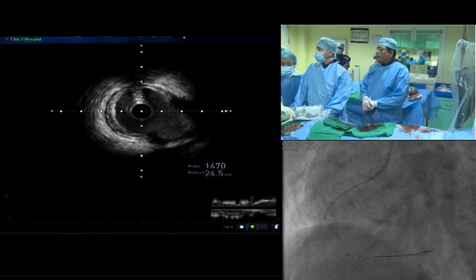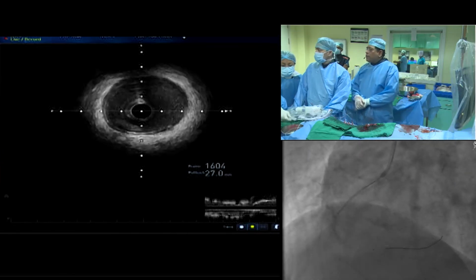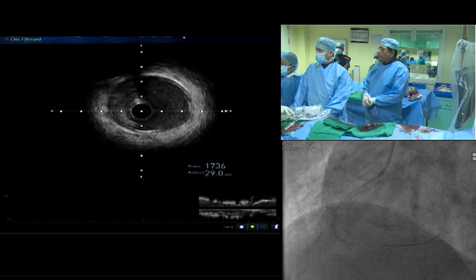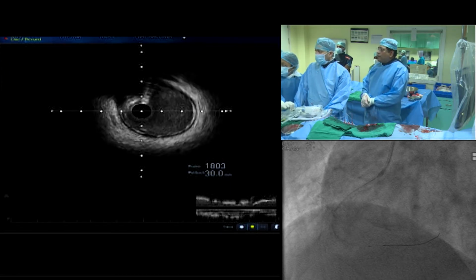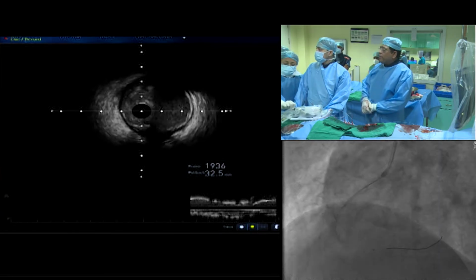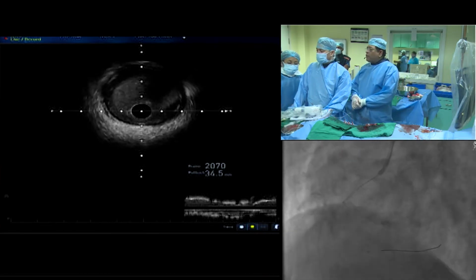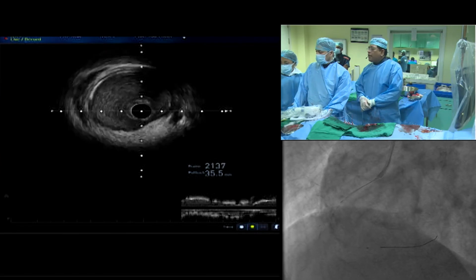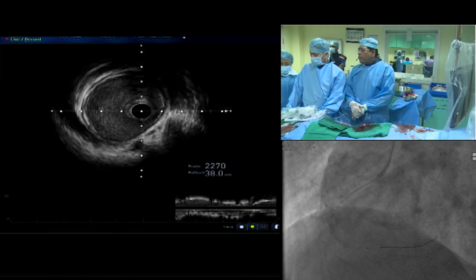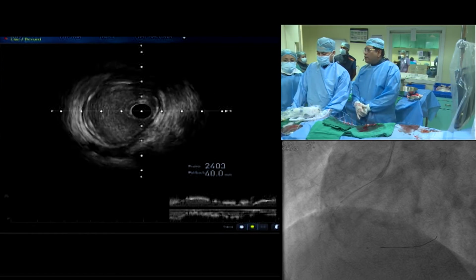So all along we have got till now no reason to think of any stent. Okay, so this is a good lumen, and you can appreciate there is absolutely no FFR needed. So what it appeared in the angio, maybe because of the only one shot which we took. So it's again an authentication that IVUS gives you so much of information, and you can do away without any invasive work.